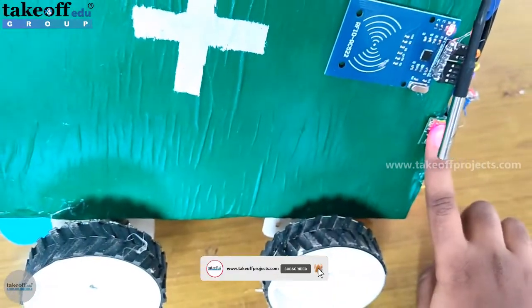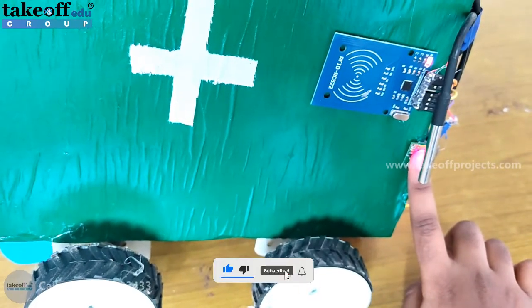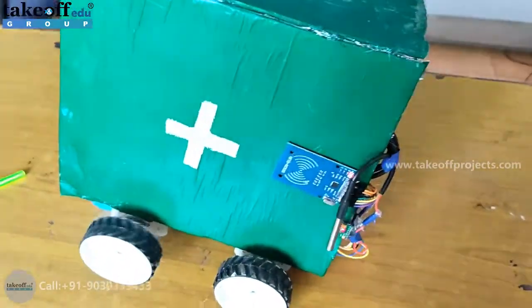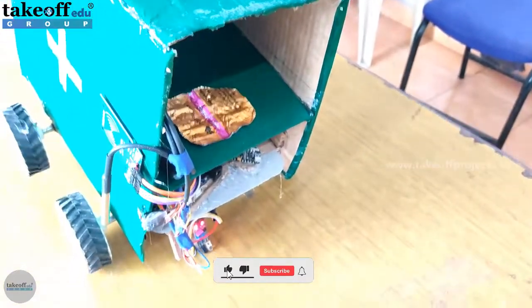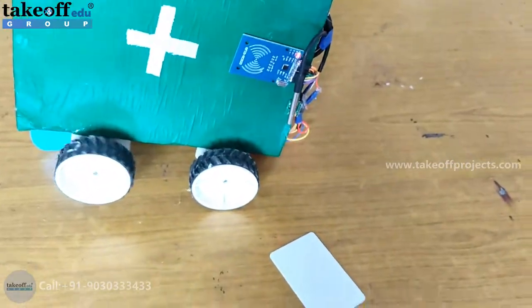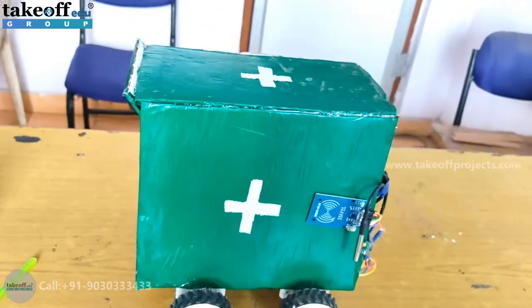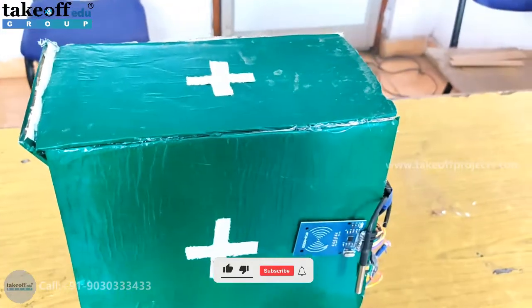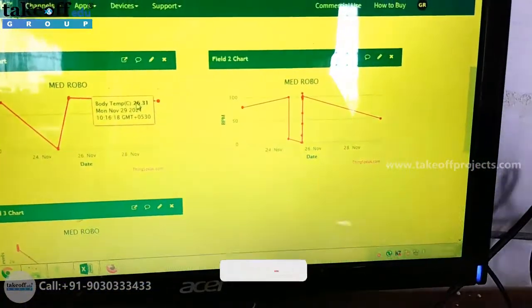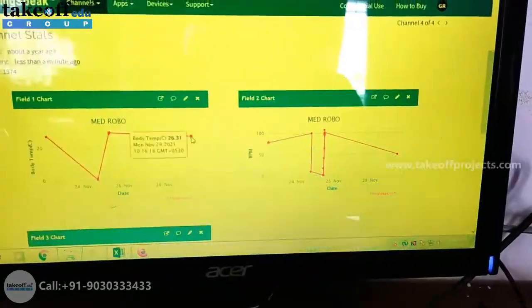The next patient comes, swipes his card, and keeps his finger on the sensor. Let's see the details of how it is uploaded on the ThingSpeak server. Go to thingspeak.com in Google Chrome and log in with your credentials. Once logged in, you can view the channels of body temperature, heart rate, and oxygen levels. That three-parameter data is being uploaded to this server and you can view it in graphical format.